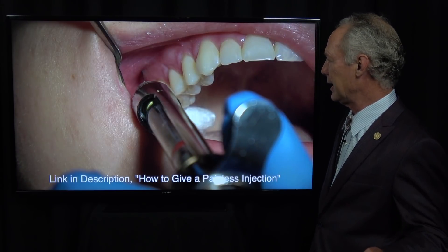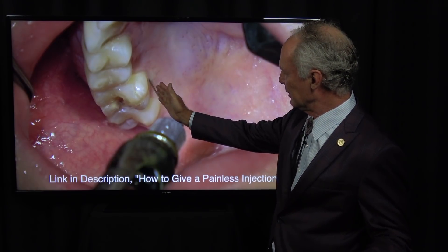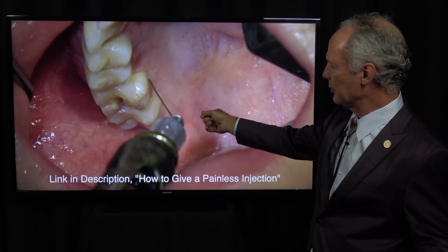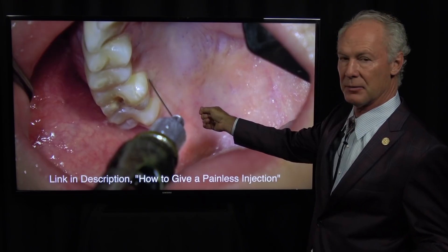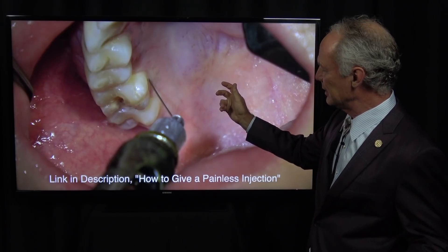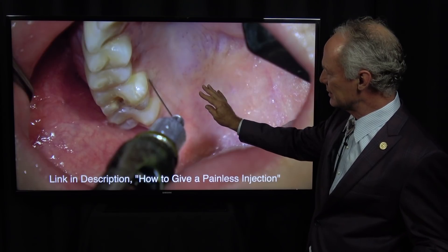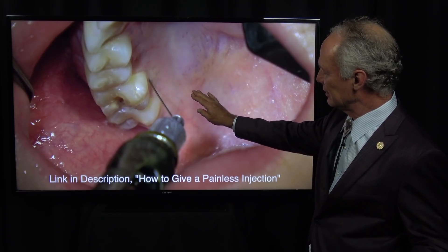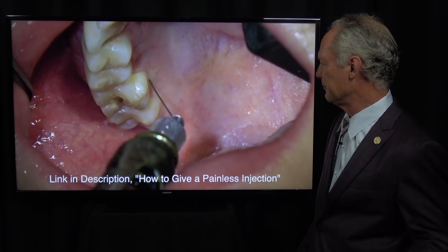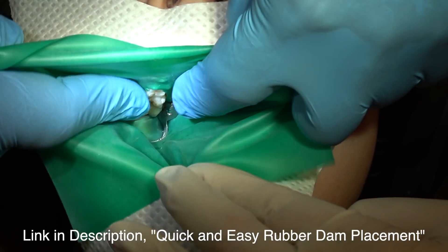Local anesthesia — painless and profound. For the intraligamental injection, you turn the bevel of the needle toward the tooth. Spray the area with Hurricane topical spray before placing the needle, and just barely place it in the sulcus. Tap the end gently so that you anesthetize the tissue ahead of the needle before applying forceful pressure on the syringe.